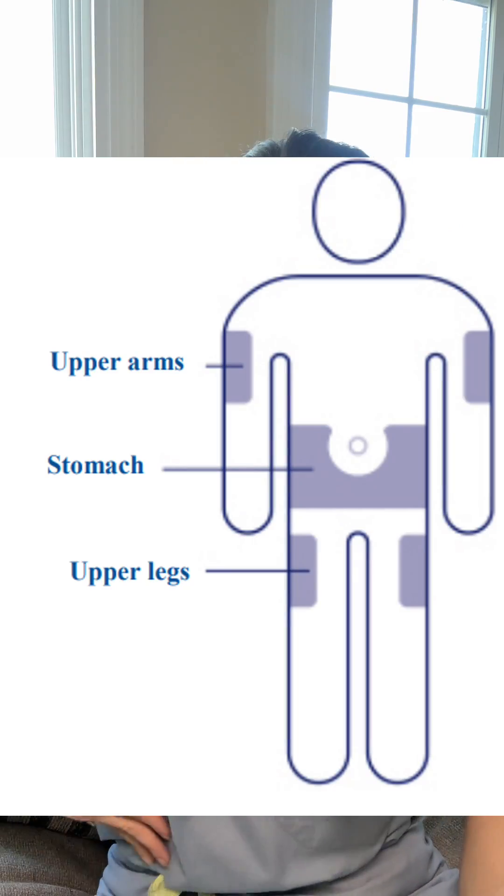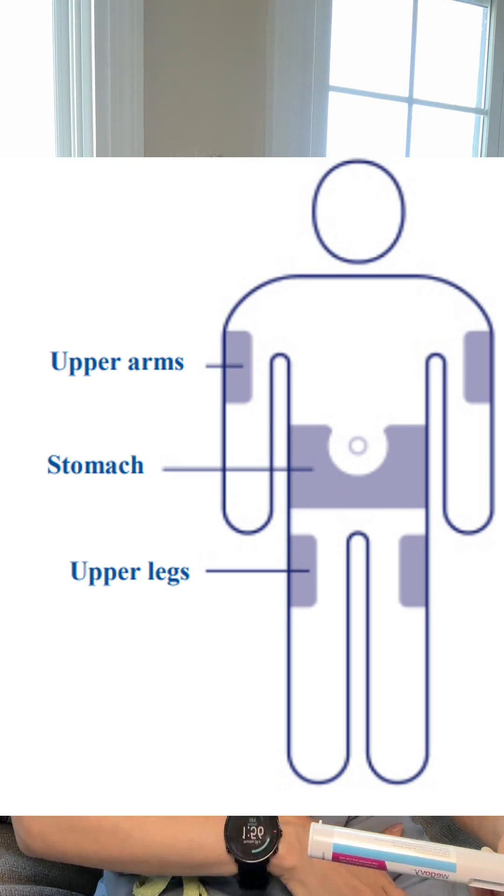Then you're going to wash your hands and choose the injection site. This site could be the upper arm, the side of your abdomen, or the side of your thighs. You're going to clean the area with some alcohol and then proceed to remove the cap of your pen.